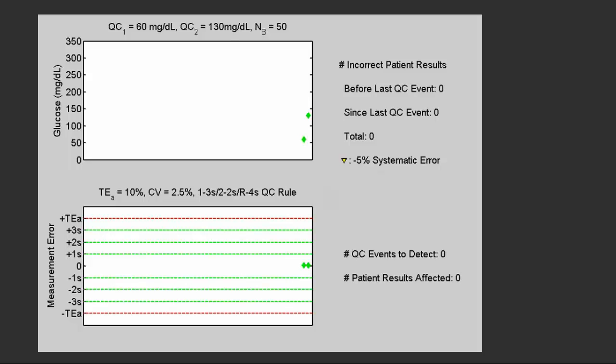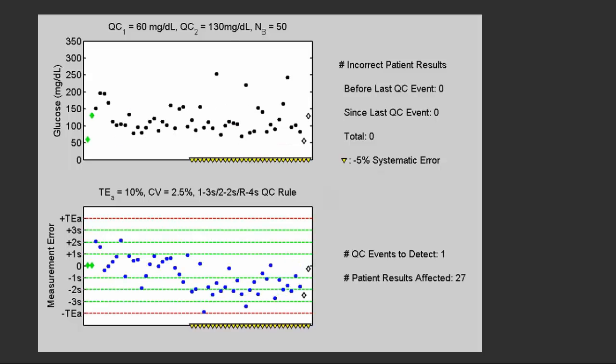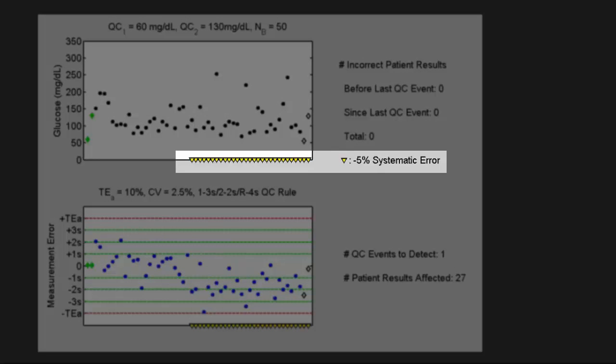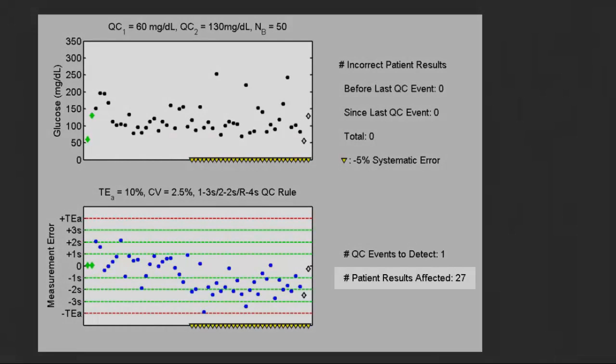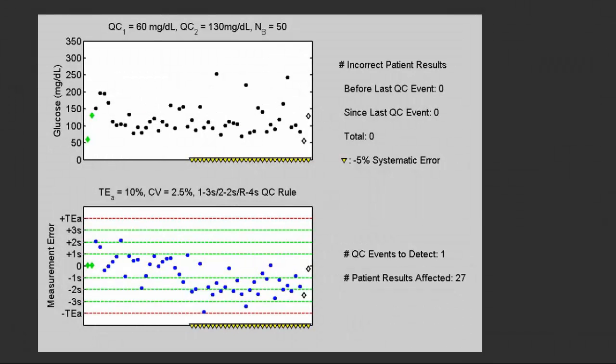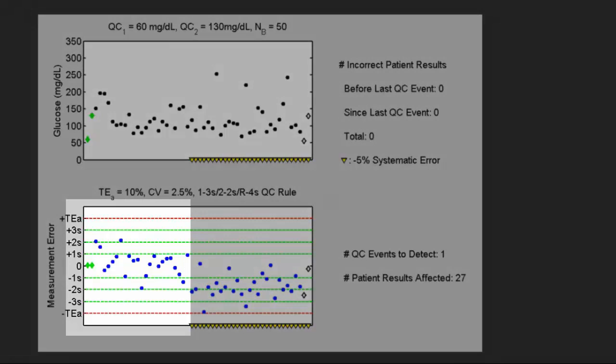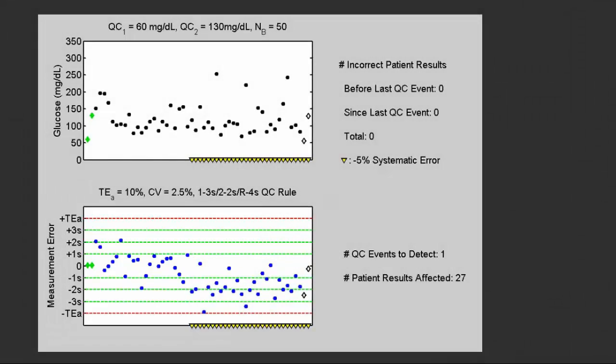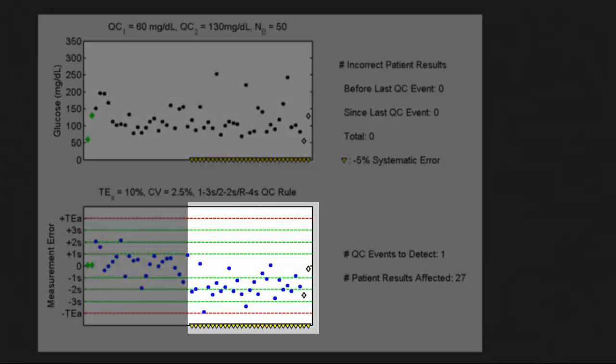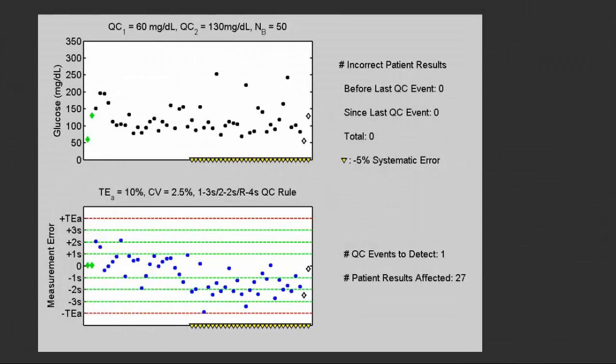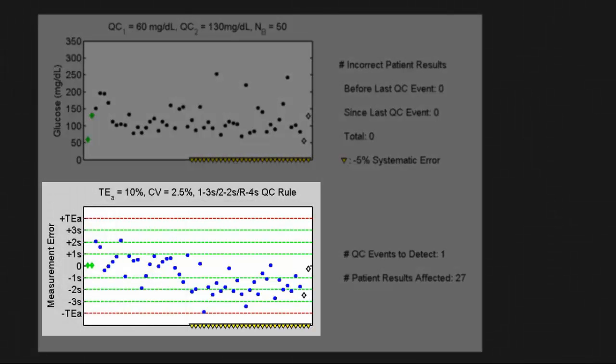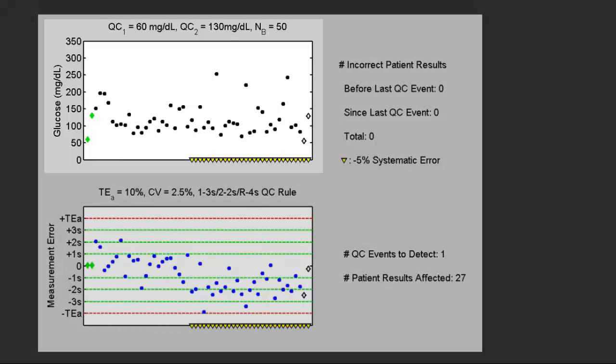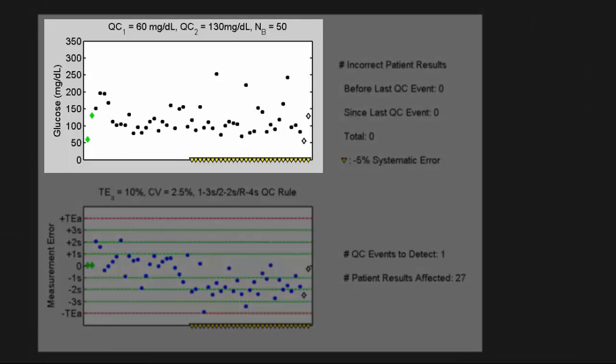So we test patient results. The point in time where the yellow triangles appear is the point that a systematic five percent shift down in the process occurred. That happened 27 patient results prior to the next set of QC's. You can very clearly see the two CV shift downward in the measurement errors. Prior to the yellow triangles, the blue dots are centered around zero. Now they're scattering around minus 2s. It's easy to appreciate the effect of the five percent shift down in the distribution of measurement errors.